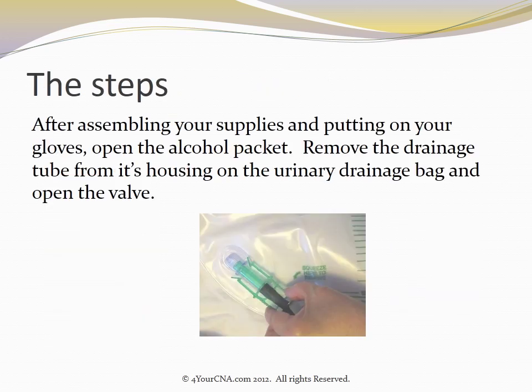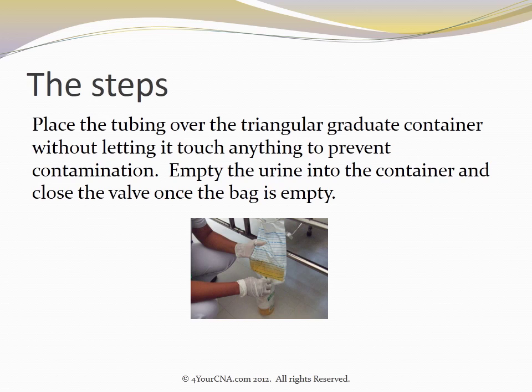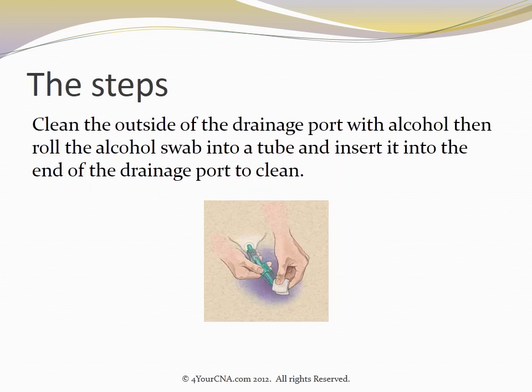After assembling your supplies and putting on your gloves, open the alcohol packet. Remove the drainage tube from its housing on the urinary drainage bag and open the valve. Place the tubing over the triangular graduate container without letting it touch anything to prevent contamination. Empty the urine into the container and close the valve once the bag is empty. You will clean the outside of the drainage port with alcohol and then roll the alcohol swab into a tube and insert the tube into the end of the drainage port to clean.